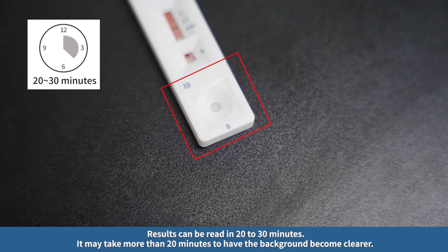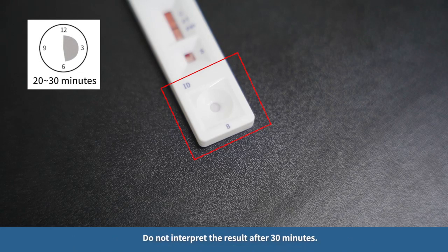Results can be read in 20 to 30 minutes. It may take more than 20 minutes for the background to become clearer. Do not interpret the result after 30 minutes.